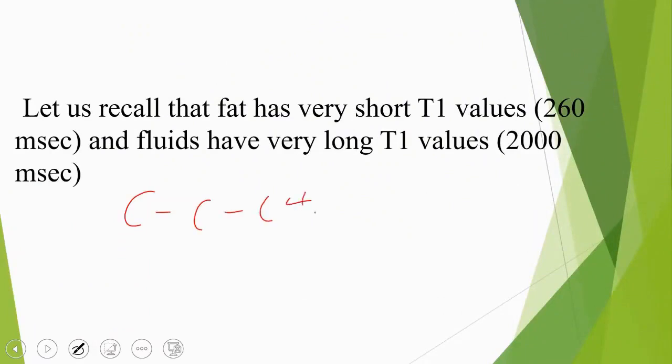It is a chain of carbon atoms, the structure of which belongs to fats, or a chain of carbon atoms ending with a carboxylic group, which is a double bond with oxygen. The hydrogen atoms present are a result of these carbon atoms being saturated. What does saturated mean? It means they are bonded and do not have electrons or charge. We always say that the magnetic field is related to charge. If you find any atom with a charge, you know that it has a magnetic field around it. Since the atoms have a magnetic field around them, they will be affected by and will affect the surrounding magnetic field. In the triglycerides, I refer to the hydrogen atoms present in this structure as shielded.